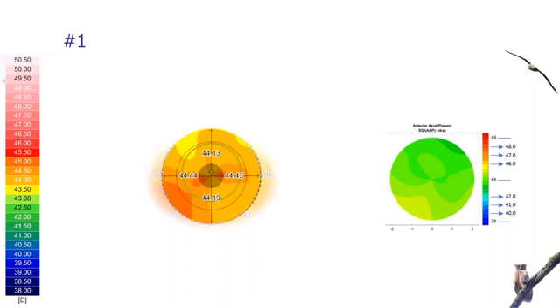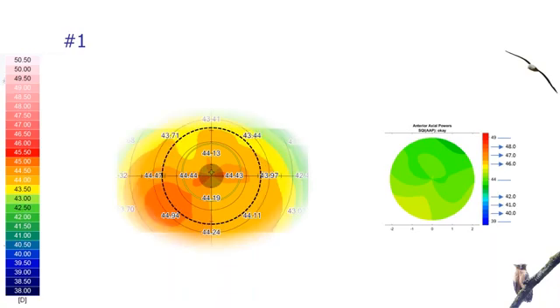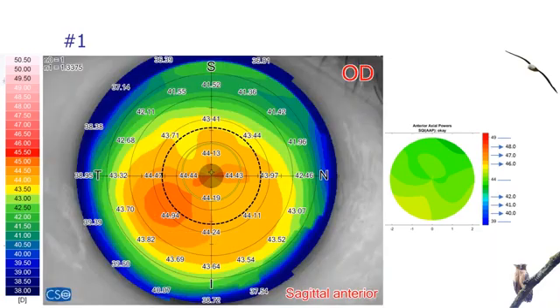The Sirius is a full-blown corneal map all the way to the periphery. IOLMaster 700 is just between the 4 to 5 millimeter zone. However, the 4 to 5 millimeter is functional because that's where we see. Anything more is just corneal shape rather than something very functional. We will elaborate more on this later.